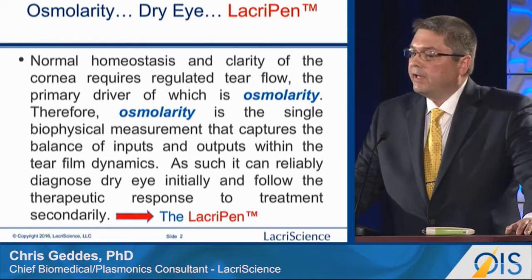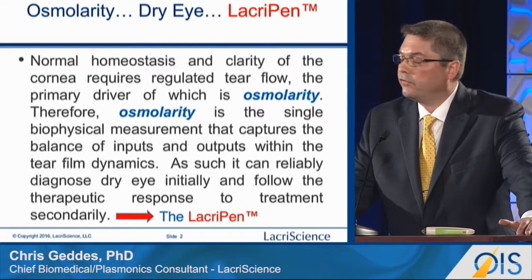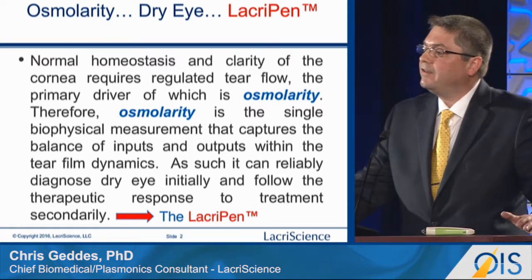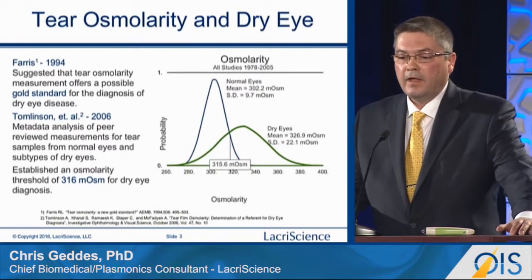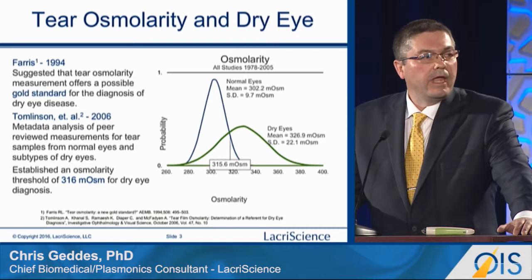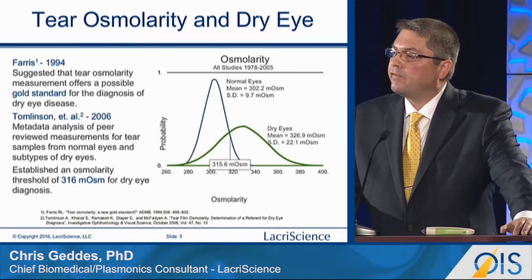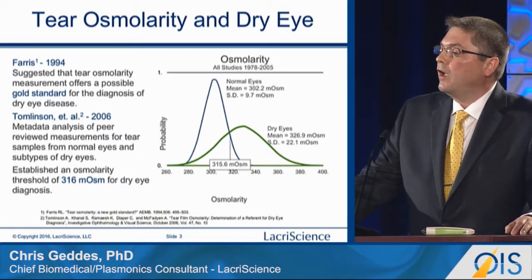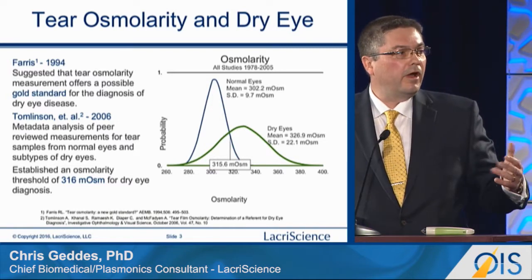We all know that osmolarity is really the single biophysical measurement that captures the balance of inputs and output flows within tear film dynamics, and hence it's ideally suited for the diagnosis of dry eye. As a community, we have known that osmolarity can diagnose dry eye for several decades. In fact, a lot of work by Farris, Tomlinson, and a few others has correlated the degree of tear osmolarity with the onset of dry eye syndrome.